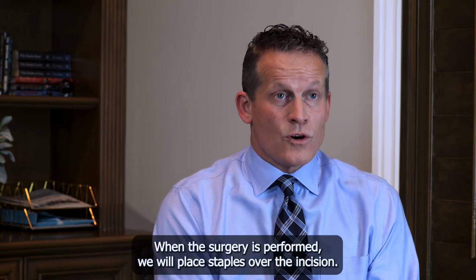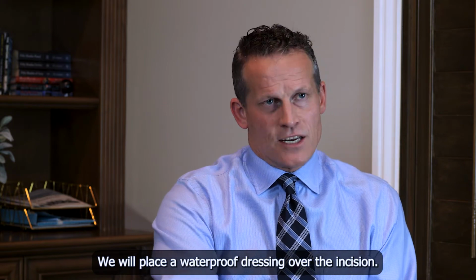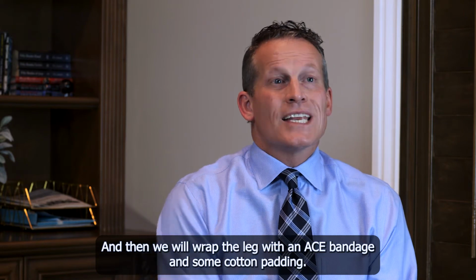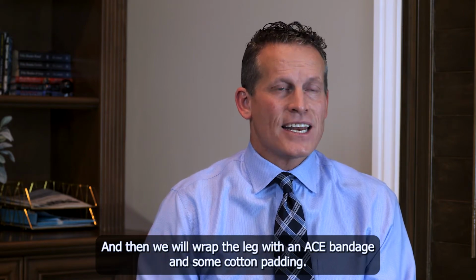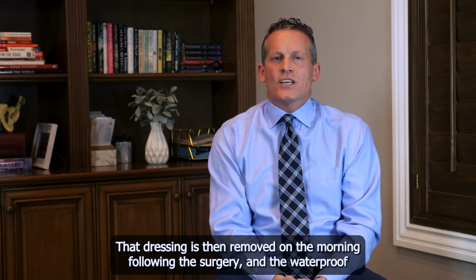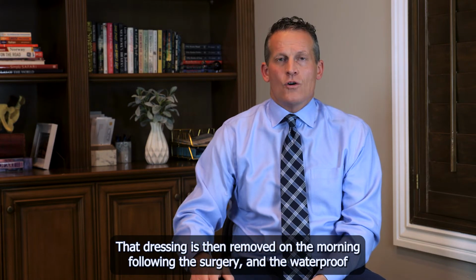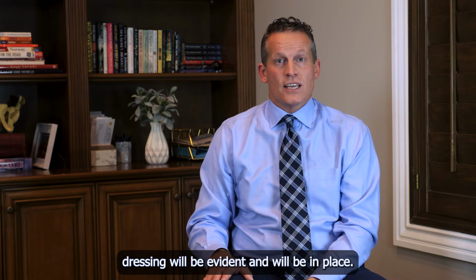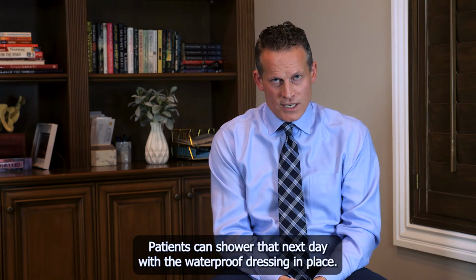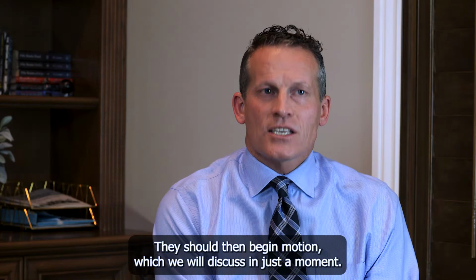When the surgery is performed, we will place staples over the incision. We will place a waterproof dressing over the incision. That's the bandage. And then we will wrap the leg with an ACE bandage and some cotton padding. That dressing stays on for 1 day. That dressing is then removed on the morning following the surgery, and the waterproof dressing will be evident and will be in place. Patients can shower that next day with the waterproof dressing in place. They should then begin motion, which we will discuss in just a moment.